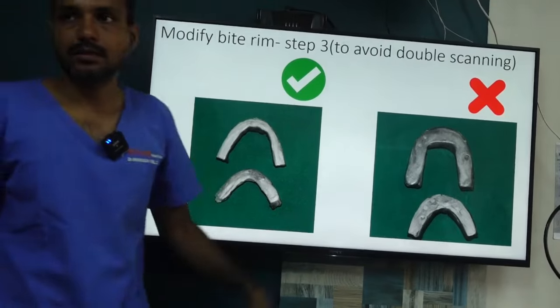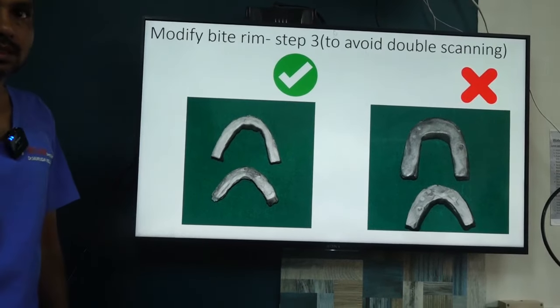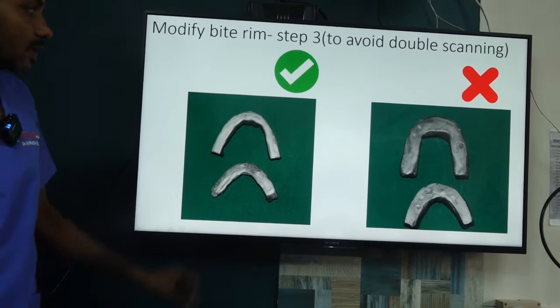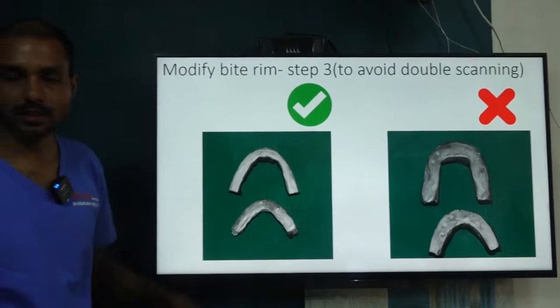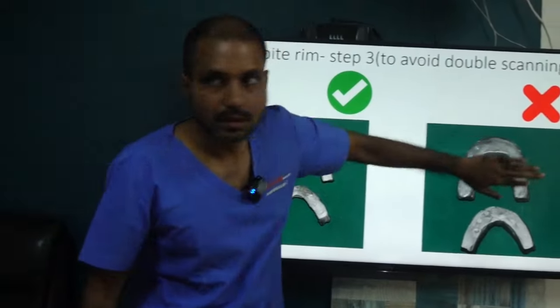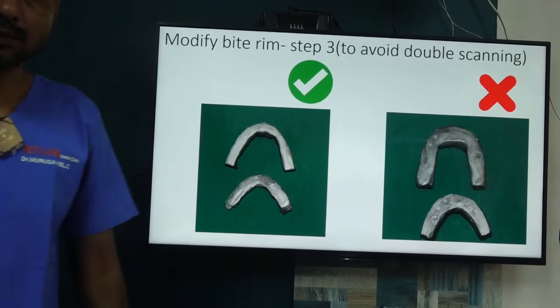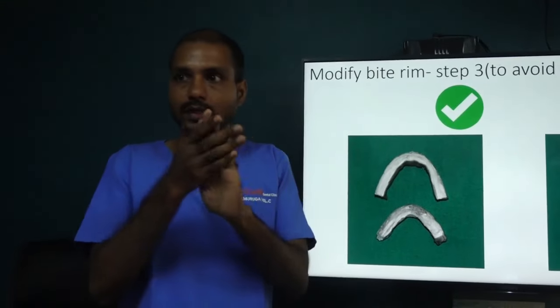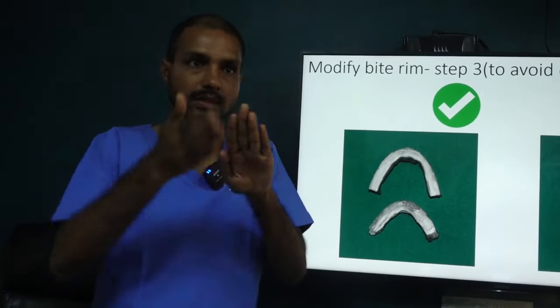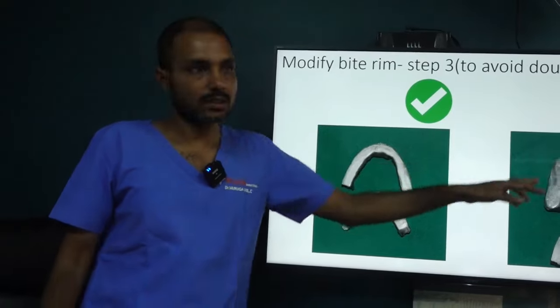So keep it thin. Do you understand this? If it is thin, when you do like this, immediately it will catch here, immediately it will catch here. But if it is too wide, it won't catch. It will get confused. Imagine if it is a natural tooth, it is only very thin, incisor edges, it will easily catch. But here it is thick.